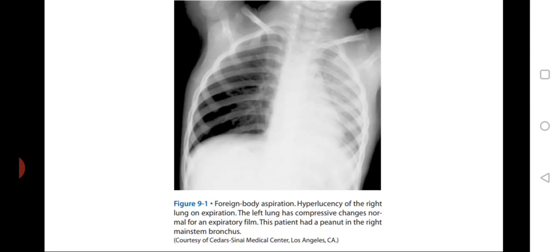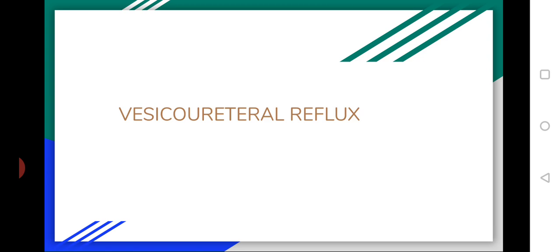CT scan and MRI can help sometimes, but they are not the best techniques for this situation. In the imaging shown here, you can see that the lungs look completely different on both sides — because air is getting into one lung but not the other. That is how we can suspect there may be a foreign body somewhere. Of course, this is not the only possible cause of such an image, but it is one of the possibilities.